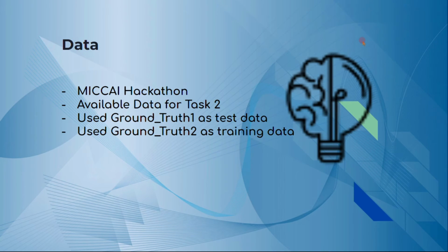About the data, the data used is the head CT data available on the MICCAI Hackathon website for task 2. I used two series of images which were available in TIFF format. I used group 1 as the test data and group 2 as the training data.